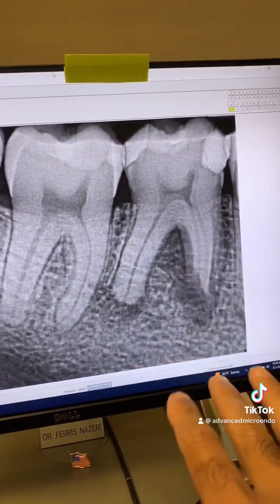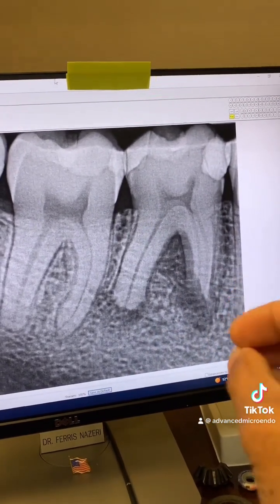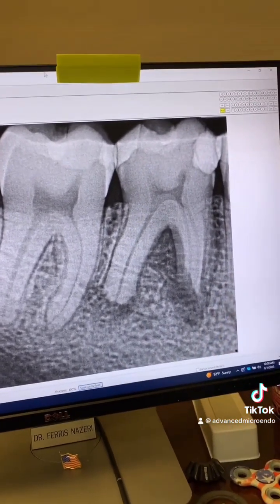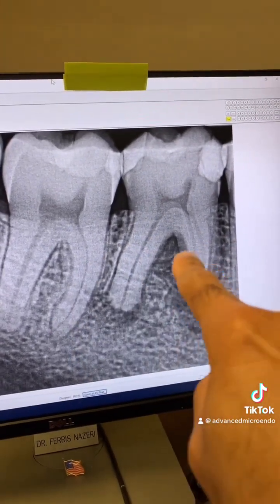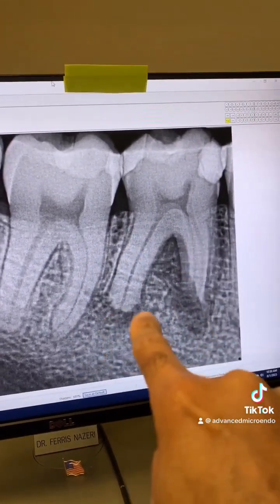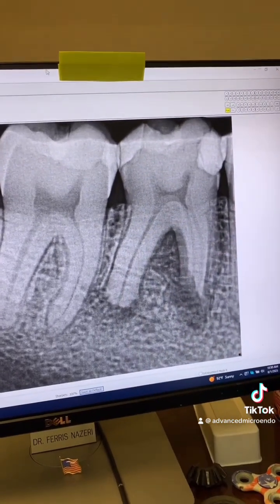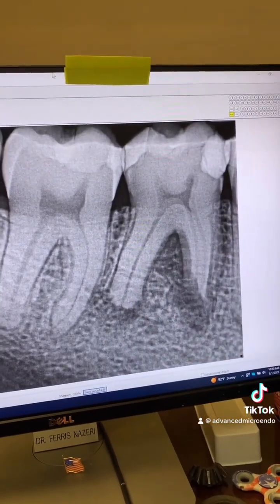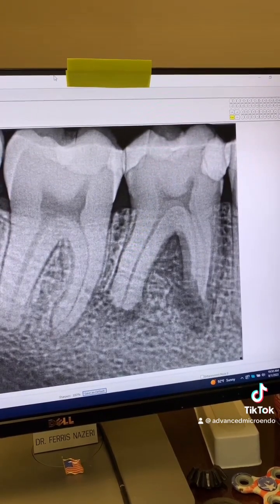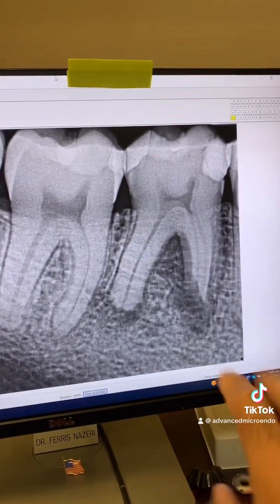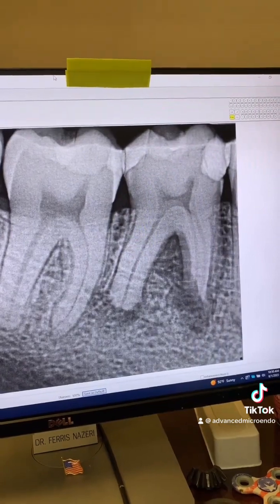When I look at a tooth like this, I can envision what it will look like after I'm done with it. In this case, I can see MTA here and here, after all of the cleaning, shaping, irrigation with full-strength sodium hypochlorite and activation — all that stuff. But I can already see the end result in my head.